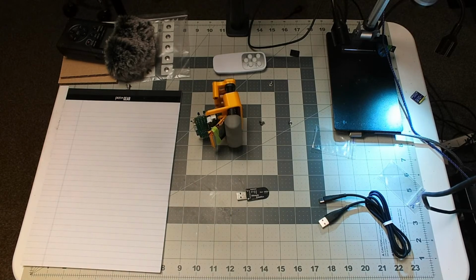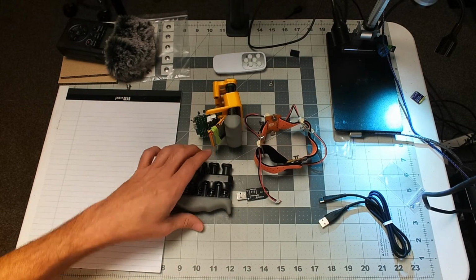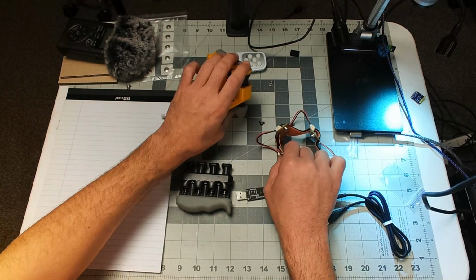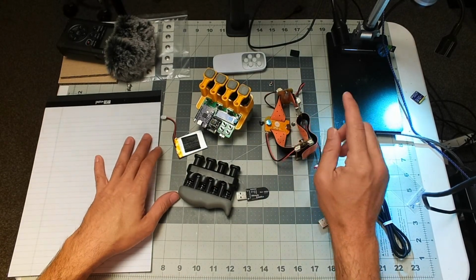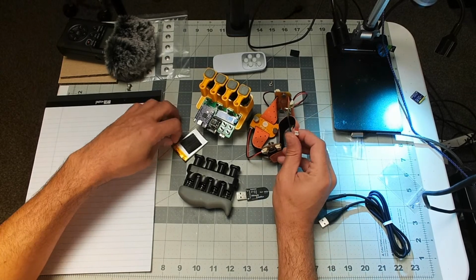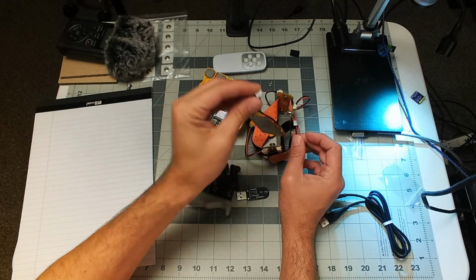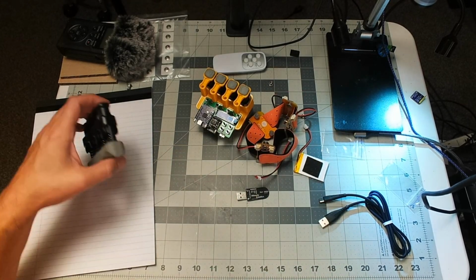So we have the LASK system. We have our uMyo band. And I have Diodario. And we have our spare battery. So I believe our battery is good. I might actually solder something today to make the double female side of the JST plugins, because the battery that I got has the opposite polarity, and it's also too big for the JST plug, so I'm just using a header pin here. But that should be fine.